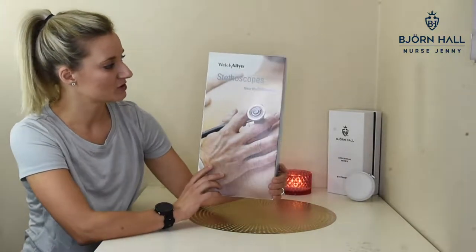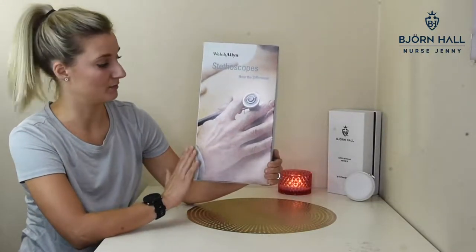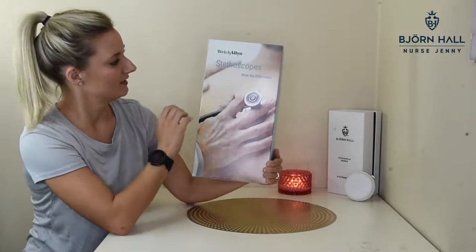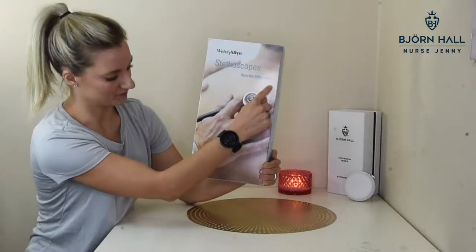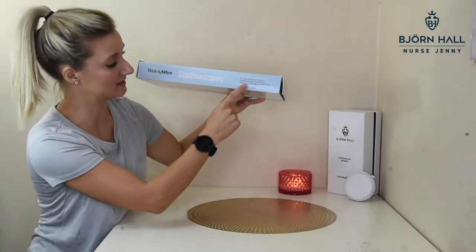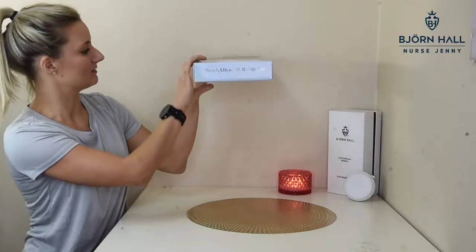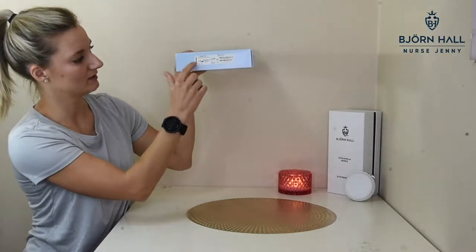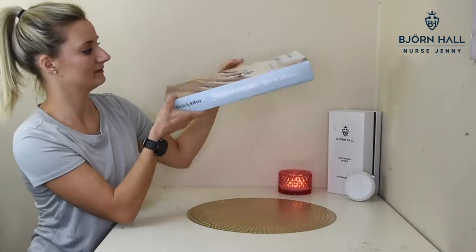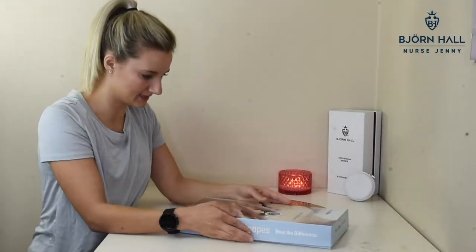Okay, here we've got the Welch-Allen box. It's got a picture of a stethoscope, which is not the stethoscope you get in the box. All the boxes look the same from Welch-Allen, and it's got the same stethoscope on the front. It says 'Welch-Allen Stethoscopes - Hear the Difference.' On the side, we've got the address of their headquarters in the United States. On another side, just the brand name Welch-Allen, and on the other side, just the barcode. And on the back, as usual, there's nothing.